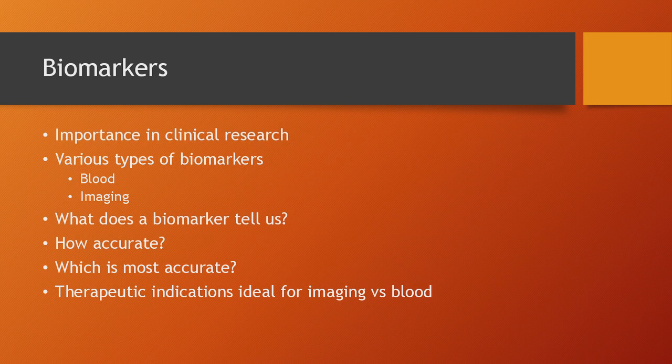But we refer to imaging biomarkers as those parameters that we can extract from medical images after applying the appropriate computational analysis techniques. For that, we always use computing and algorithms, mainly techniques like artificial intelligence or machine learning.